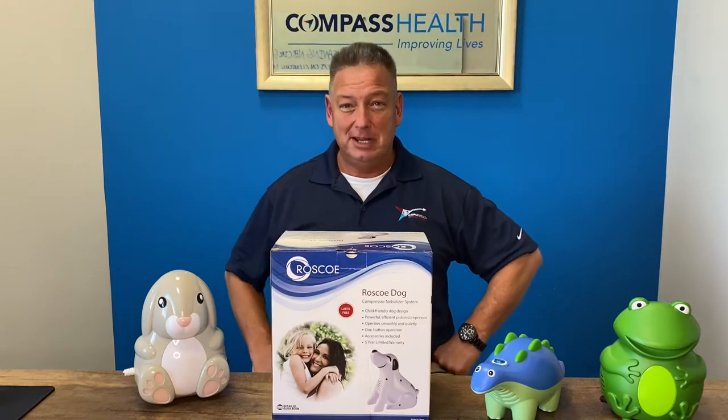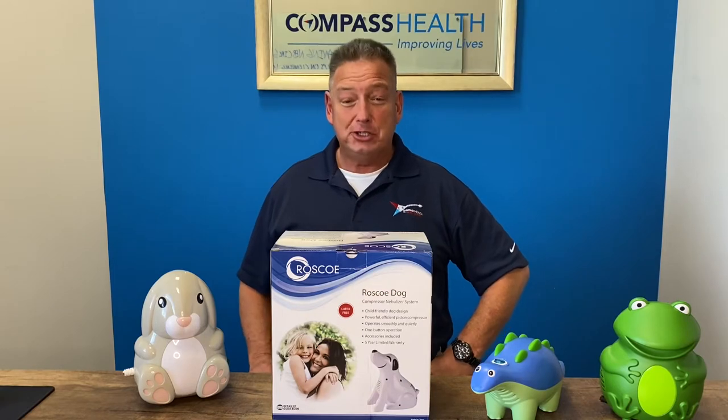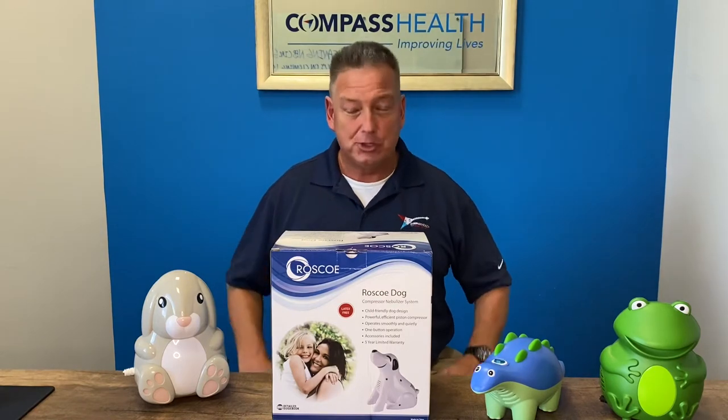Hello, Devin Drysdale with Compass Health Brands here. I'd like to talk to you today about the Roscoe Medical line of child-friendly nebulizer compressors.